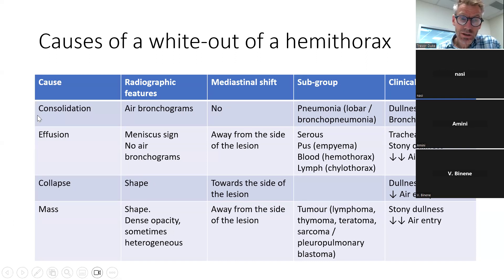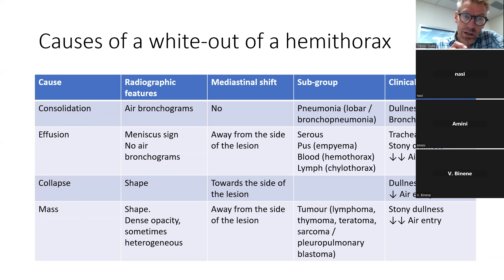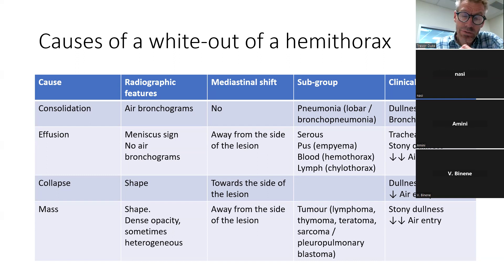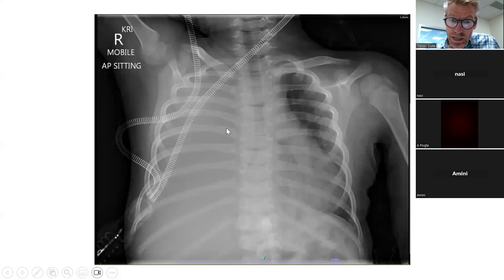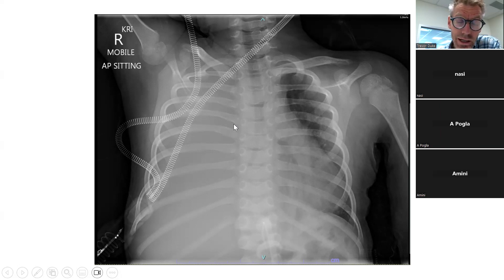There are only four things that give you a white-out of a hemithorax: consolidation, effusion, collapse, and a mass. When looking at the X-ray, you can determine which is most likely and rule out others. With consolidation, the key radiographic feature is that you should see air bronchograms — the air in the bronchi going to the periphery. In this X-ray, there are no air bronchograms, making consolidation very unlikely.